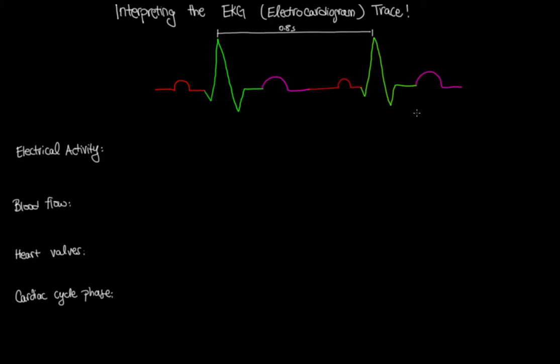In order to really understand how your heart functions, it's important to understand the electrical activities that take place in the heart and its chambers. And so we can actually detect the electrical current in the heart by means of placing electrodes on the skin and measure the electrical current using an electrocardiograph. And this electrocardiograph is going to result in a recording referred to as an electrocardiogram.